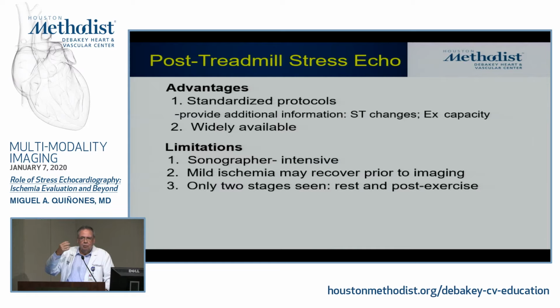And those resting images are in your memory. You're not seeing them anywhere. So now you're going right after exercise, and you're trying to get in there and get that 4-chamber, that 2-chamber, those parasternal views, and try to make them as close as possible to what we had at rest. And it's not always the case, which is one of the issues we have to deal with when evaluating these cases.